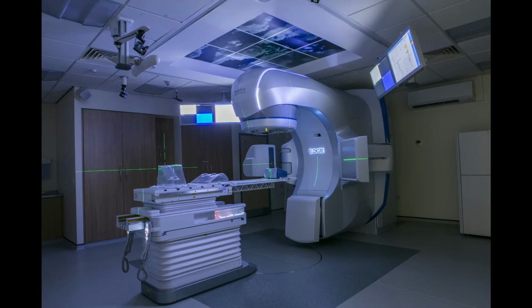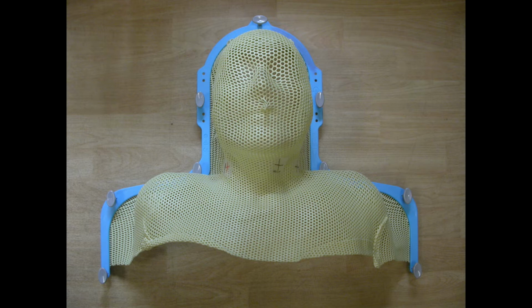In order to make radiotherapy treatment as accurate as possible, each patient has a personalised mask. The mask is designed to help keep you still and in the same reproducible position. It is made from a flexible plastic called thermoplastic.